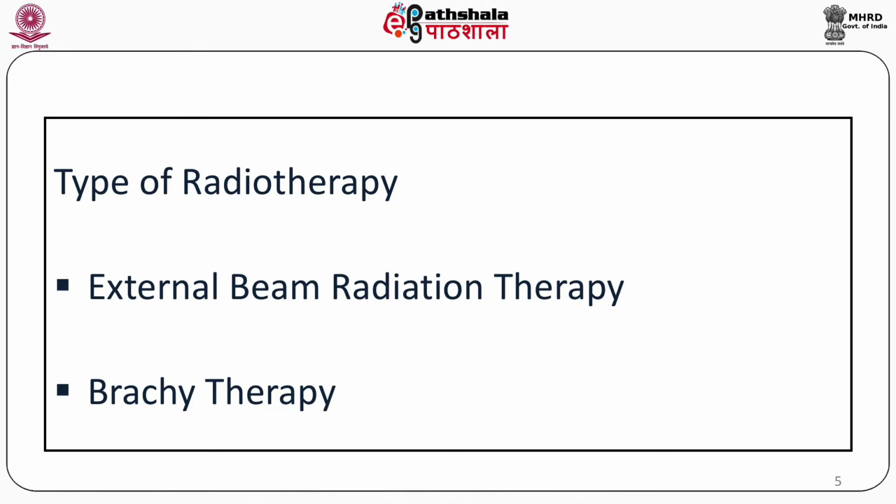The second is brachytherapy, where the location of the tumor is such that we can approach the tumor very closely, and applicators are inserted inside the body.